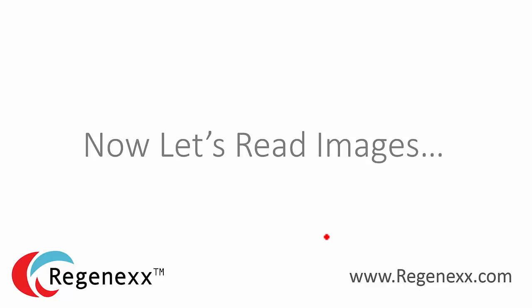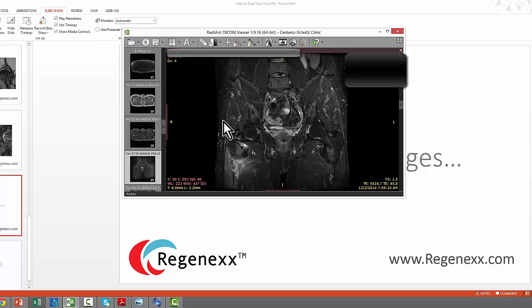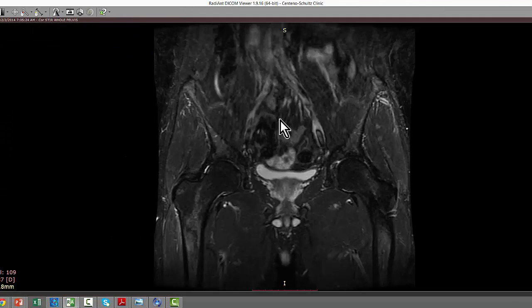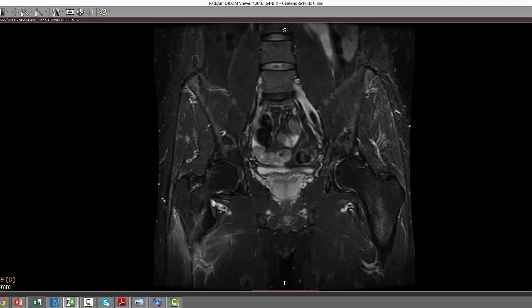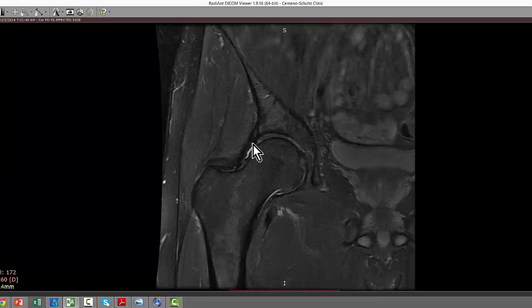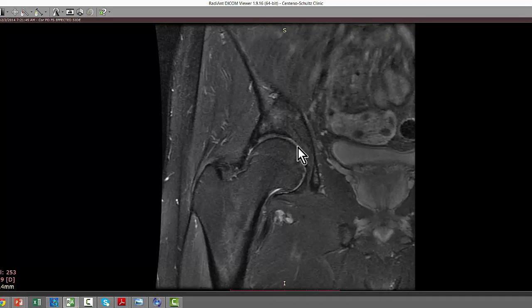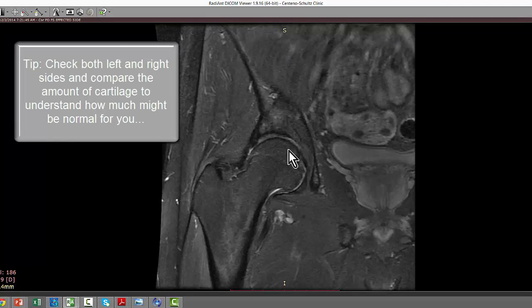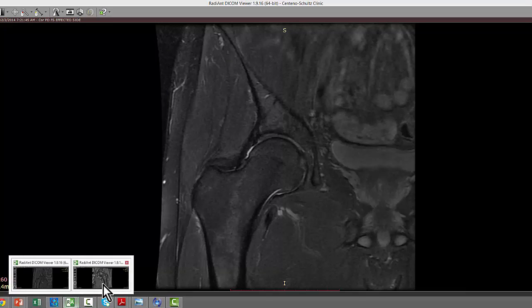Now let's read some actual images. We have a survey image that shows both hips so we can get a sense of what both look like as we scroll through. Then we look for the close-up of one hip — here you can see the labrum, the cartilage area, and the bone. There's a little light area in the labrum as we scan through. This patient has cartilage, maybe not as much as the other side, so this would be mild arthritis. The labrum doesn't look that bad, and the bone is nice and uniform.